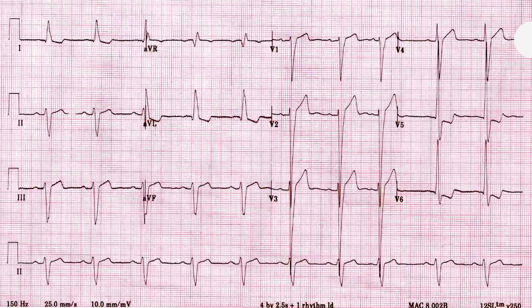One or more millimeters of ST elevation in any two leads is a terrible method for identifying STEMI. You're going to miss a lot of acute MIs using that, and you will falsely activate on a lot as well. Another key feature in LVH that I forgot to mention is because the LV is growing in that leftward angle from a vertical axis standpoint, you'll often see a left axis deviation as well, which is present here. You can see that aVL is your most upright lead, which qualifies it for left axis deviation.